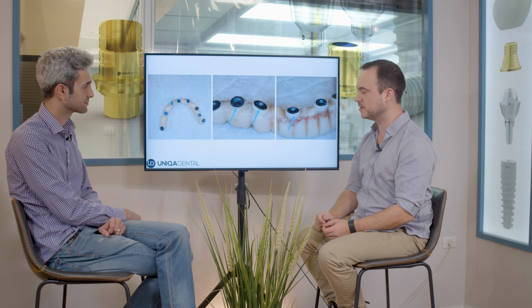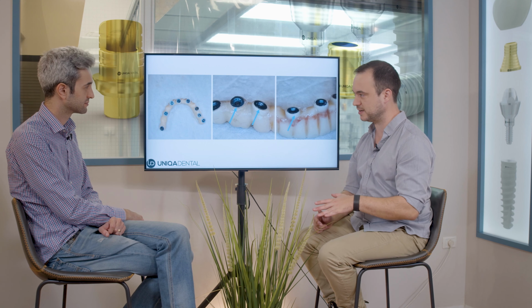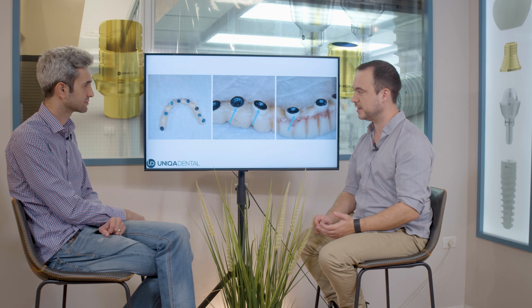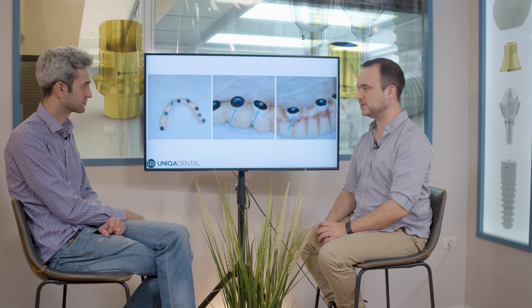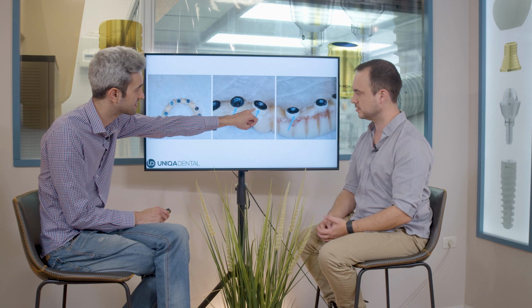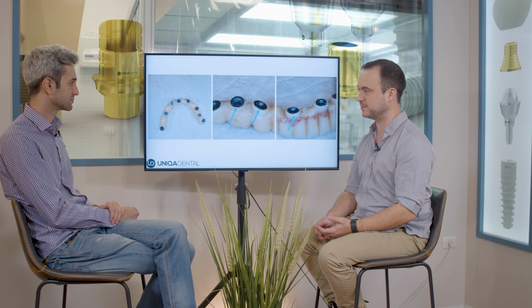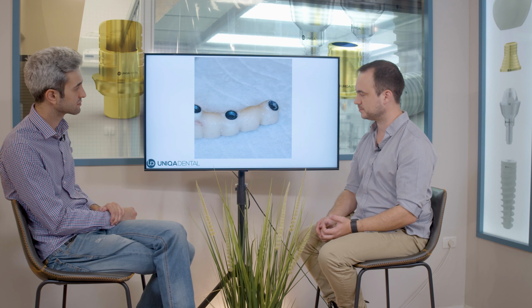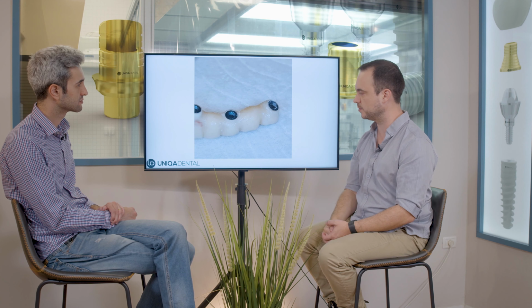And here you can see that you have a very small slot between the sleeve and the zirconia bridge. Right now you can take flowable liquid composite material, just close it up and polish it. This way you don't have any gaps for bacteria or different types of organisms. You can see the same here. Here are the residues of the cement that we had from before.